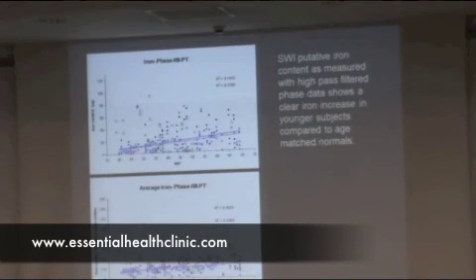So I'm going to skip a little bit here and just show you this graph that plots iron in 100 normal people. And you can see that the pink and the blue here, they increase in their iron content as we get older, from 20 to 70 years old. And the X's and triangles represent MS patients. And you can see that the young ones here actually have very high iron content associated with them. And many of the older ones, not so high iron content. That may be because we're looking at two different groups of people. Very rapidly developing, young people who have rapidly developing MS, and they may not appear on this chart because they may not be around after 40 years old. If that were the case, we might see the iron continue to go up and up like this.